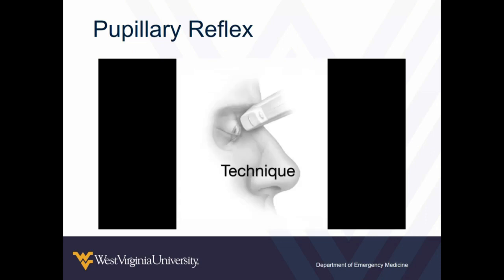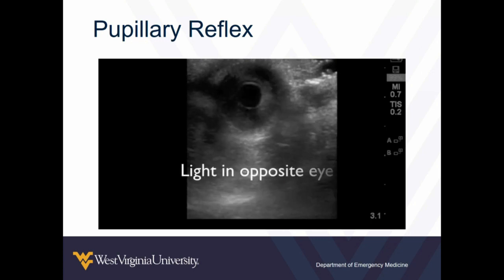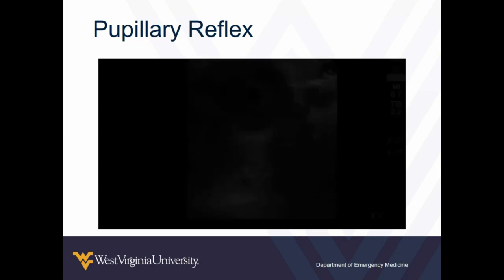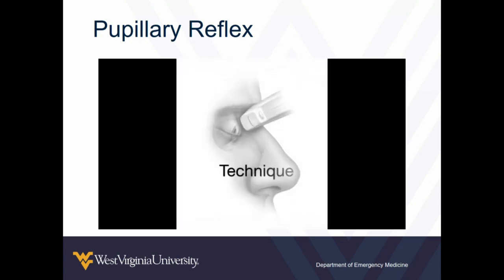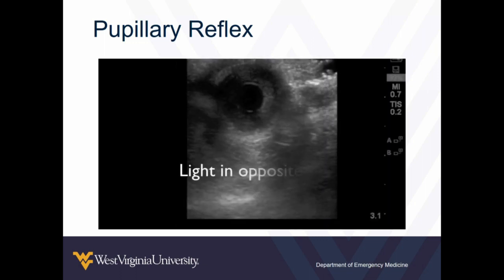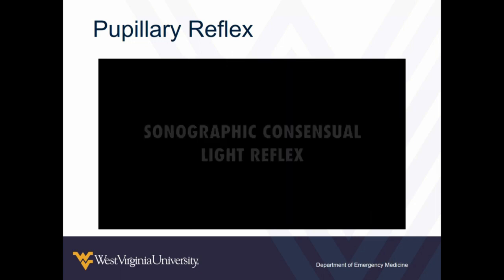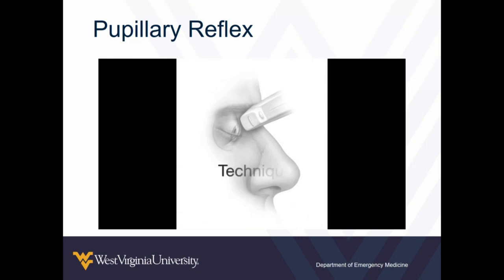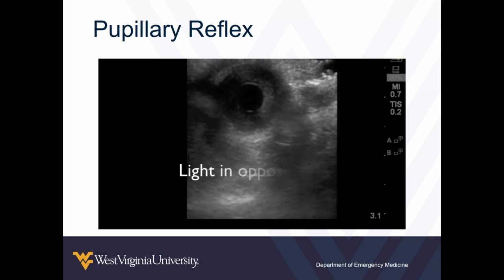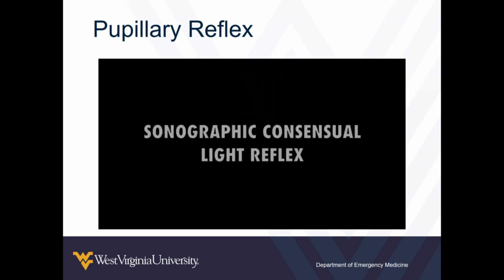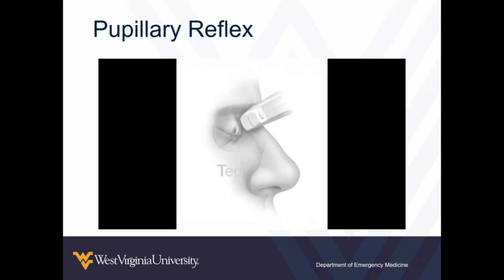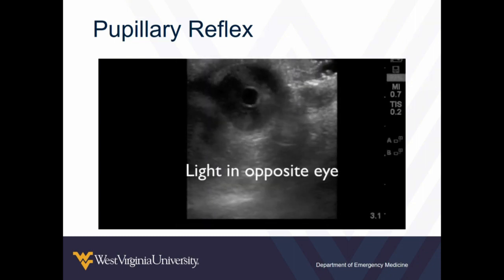I want to show you just this one cool thing you can do — and I think it's as cool as it is useful — you can check the pupillary reflex even when you can't see their pupil. So you take the right angle with your probe, you shine it down so you can get the pupil in view, then you shine a light in the non-affected eye to see the consensual response. You can determine a couple of things. The pupil's round and it's reactive, so that suggests at least some pretty basic ocular functions are intact. The caution is they have a lot of trauma to their eye — globe rupture's got to be on your list. So do this with caution, or at least at your stage now, do it with supervision of someone who's willing to take a little bit of the risk of suspected globe rupture.